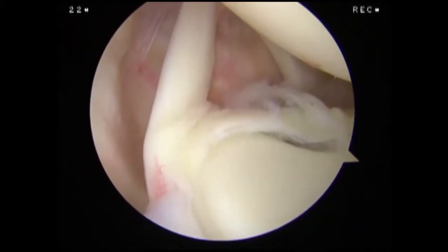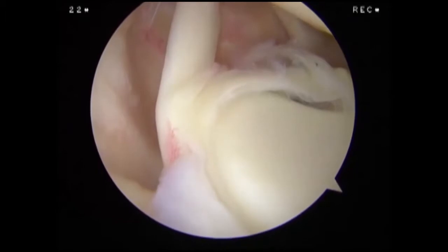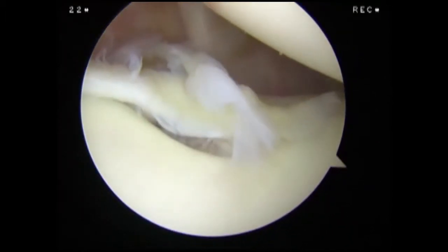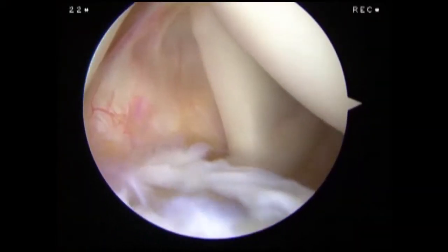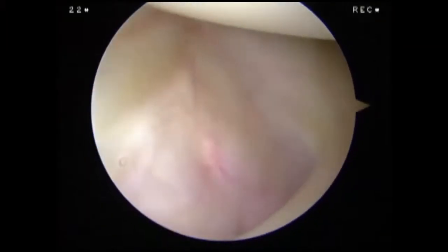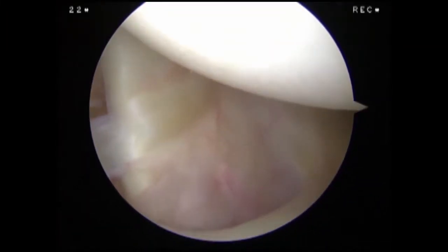We are performing a diagnostic arthroscopy in the lateral decubitus position in a right shoulder. Looking anteriorly from the standard posterior viewing portal, we examine the long head of the biceps tendon at its attachment to the superior labrum. Below the biceps tendon, we can see a tear in the anterior superior labrum. We visualize the middle glenohumeral ligament and subscapularis tendon in the front of the joint.